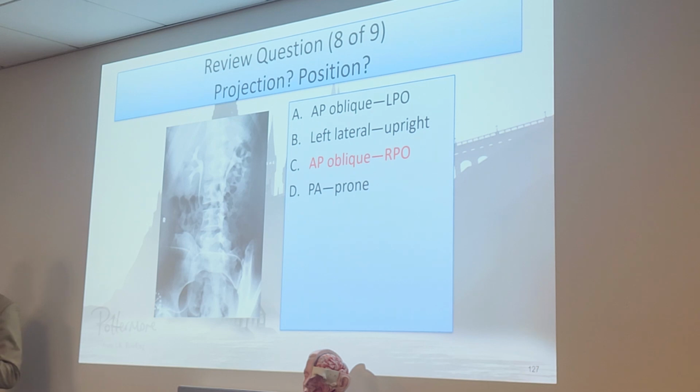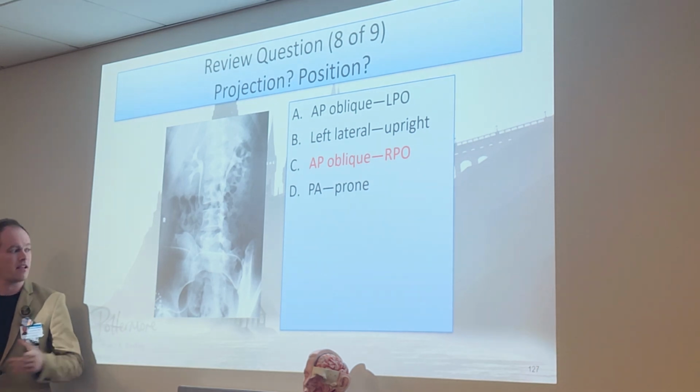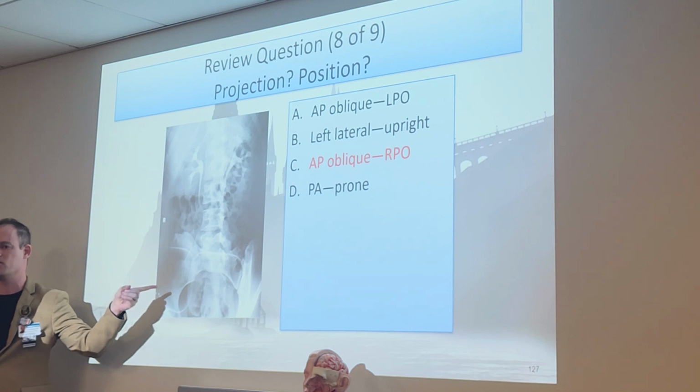Remember y'all's obliques? What is that over the body? Is that like a compression thing? It is. You remember what we talked about? We talked about compression belts. Ureteral compression belts to slow down the flow?